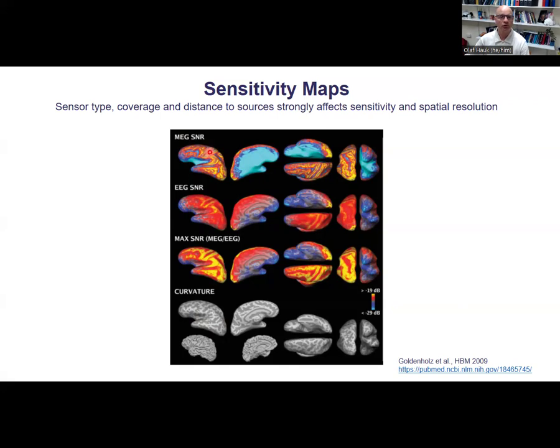So in a realistic head model, their amplitudes will not be completely zero, but there will be much lower sensitivity to these sources, much lower than for the other sources. So that explains the decrease of sensitivity with depth, as well as to some of these sources here in the more superficial areas. And with EEG, it's actually the other way around. So radial sources, if they point directly towards the electrodes, you have high sensitivity. This probably explains these stripes here.